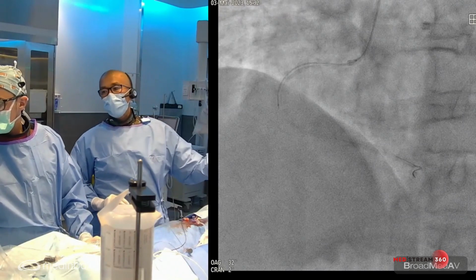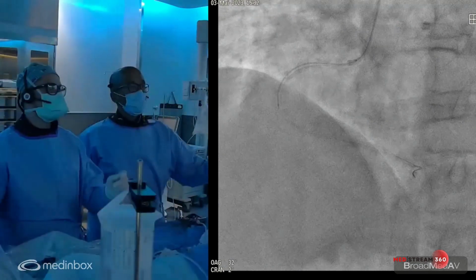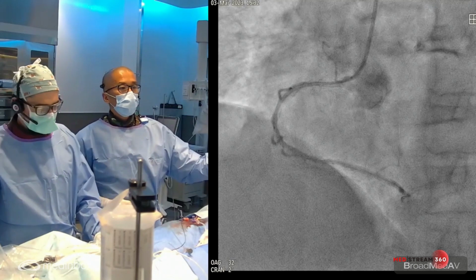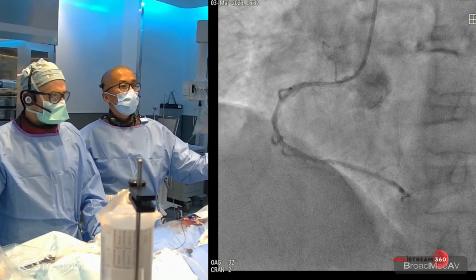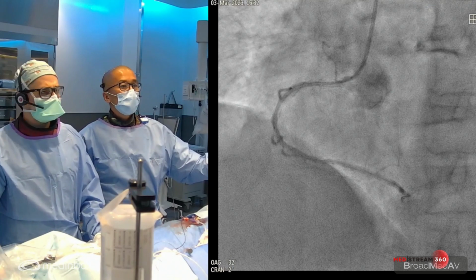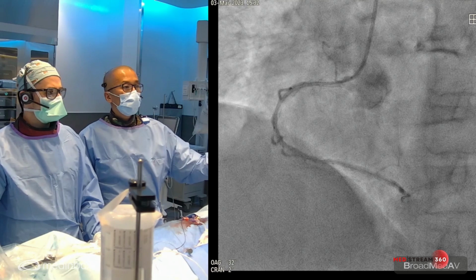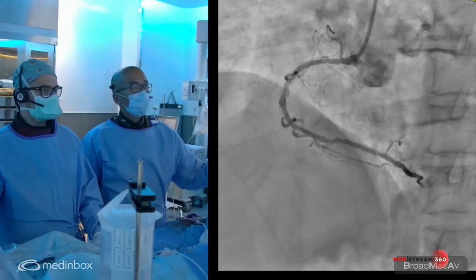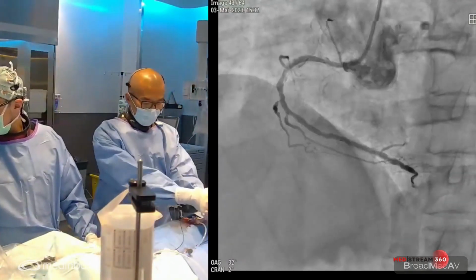So we use 4x18 and 400 psi. It's going to make sure we get good clearance, so that looks good. Okay, and enable pullback. Auto calibrate. And you'll see this live. Enable pullback. Cine. Perfect. Excellent. So we'll look at all of this together.